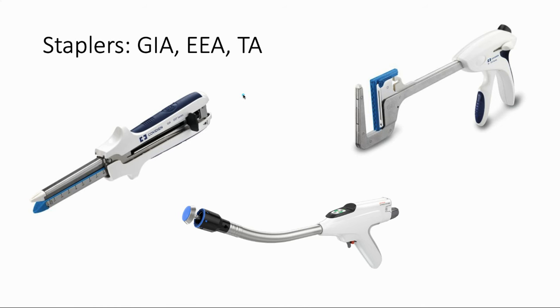And finally we have the TA stapler, which stands for thoracoabdominal — it's a general-purpose stapler. It is non-cutting, so they actually have to clamp it down and then cut across it with another instrument. Just know that those names are not some weird secret — they actually just stand for pretty much what each stapler does.